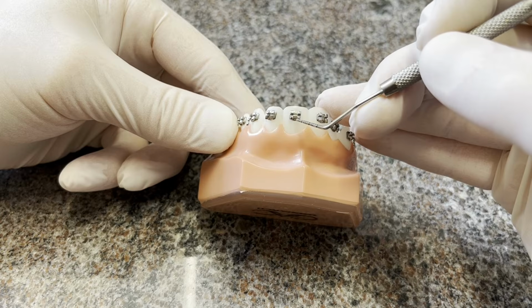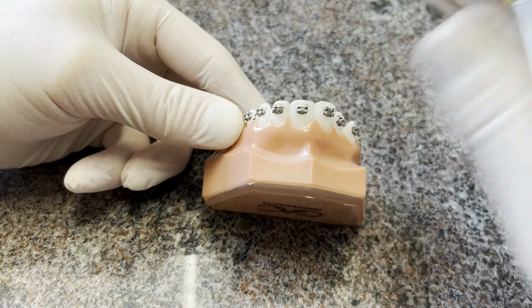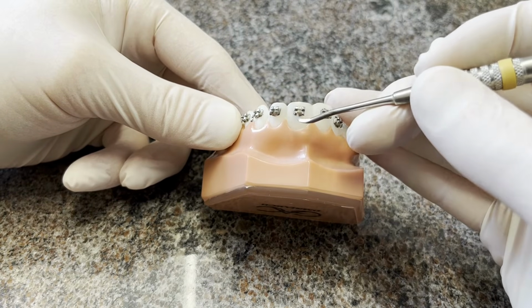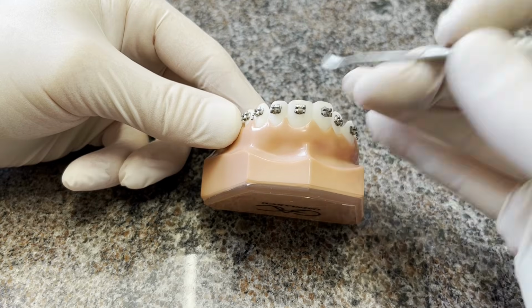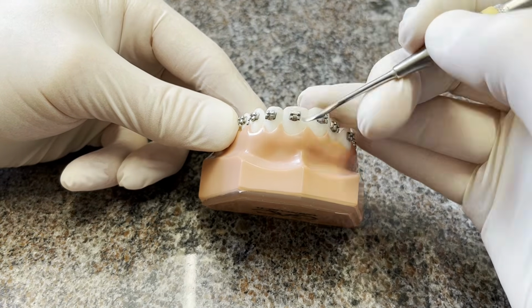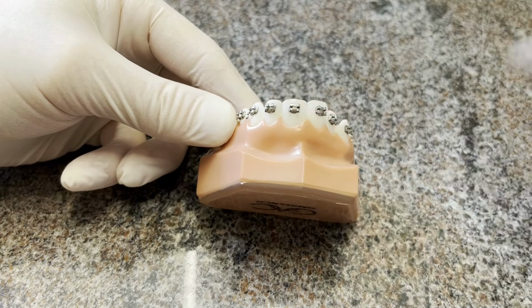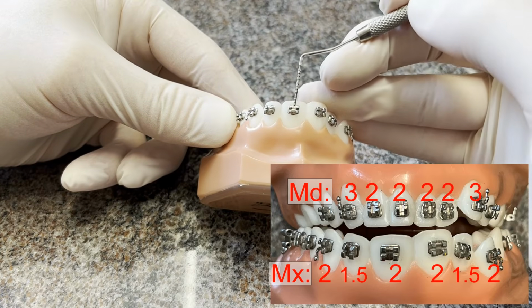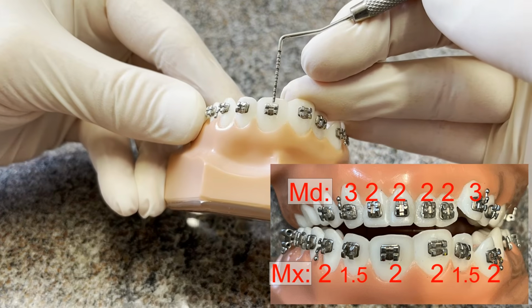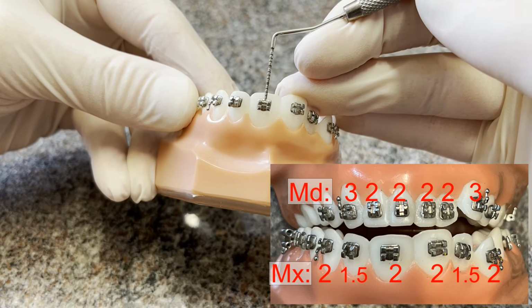The way you adjust that is you'll just take your scaler and you just tap right here. If you want it to rotate like this, you can either tap here. If you want it to come to the mesial, you'll tap this corner and that'll pivot it around. Or you can tap this upper corner if you need the bracket to move that way a little bit in addition to rotating. So I'll give it a little tap tap until it looks about right, and then I'll measure it. That's about right where I like those to be, roughly. So about the underside of that 2 millimeter mark.